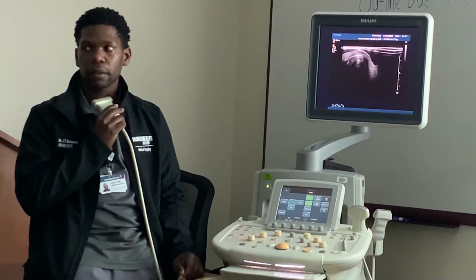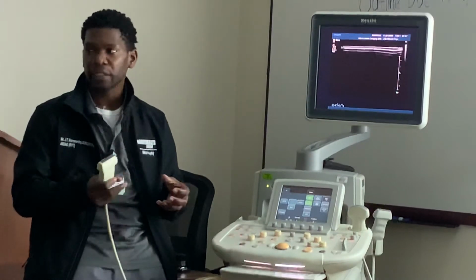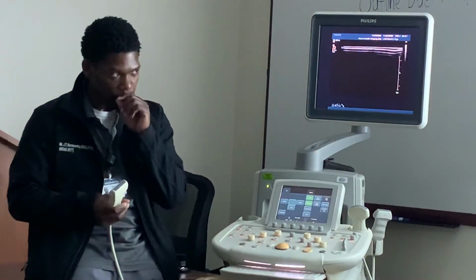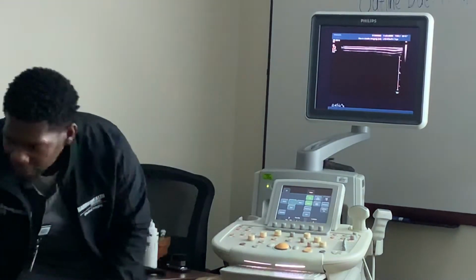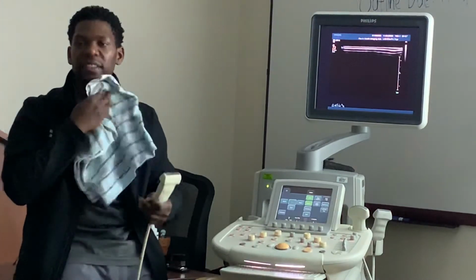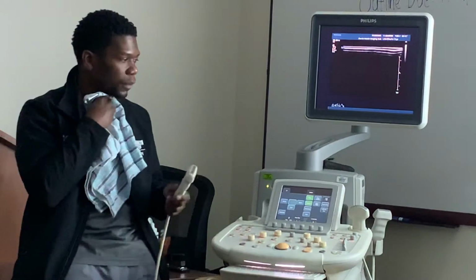We're good? Okay. So on this machine, there are 2 ways to control that: our gray maps and the compression. Gray maps does it at a bigger scale. The compression here does it more incrementally. So gray maps would do it in big jumps, whereas the compression does it in smaller steps, where you can actually see the smaller changes happening. Okay.